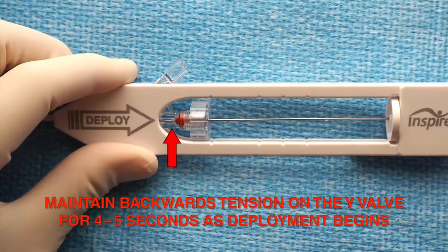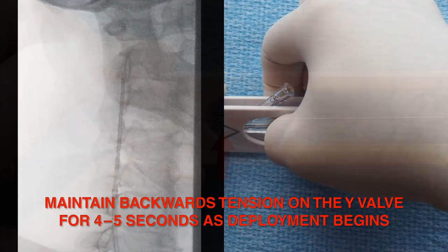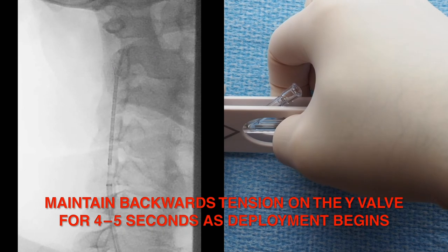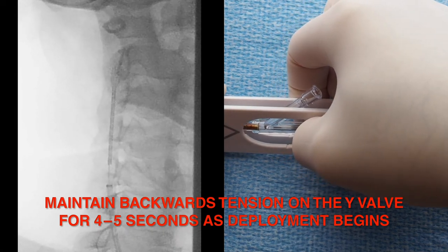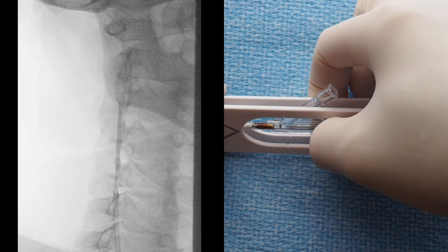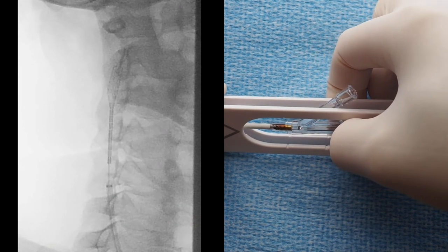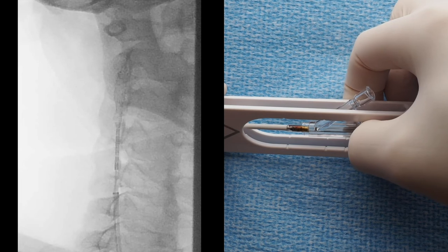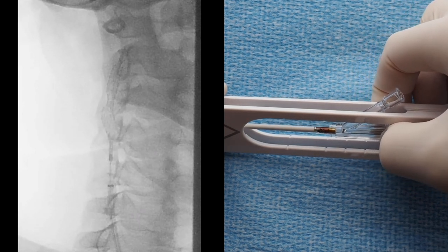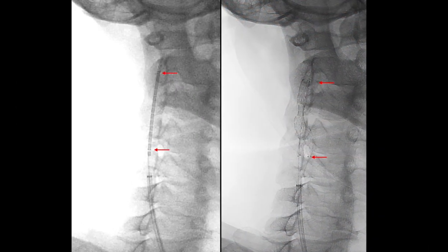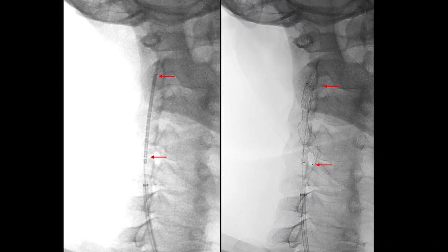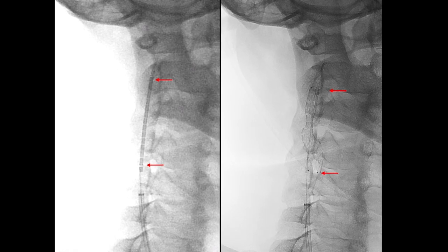Deploy the stent by holding the hemostatic valve body and slowly pull it back within the handle. Note that it may take a few seconds for the deployment to start. Continue to pull back until the hemostatic valve has reached the end of the handle and the stent is fully deployed. SeaGuard does not elongate or foreshorten, hence the proximal and distal ends will open at the intended location.